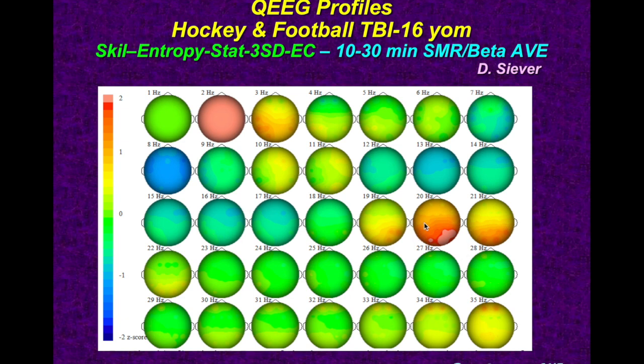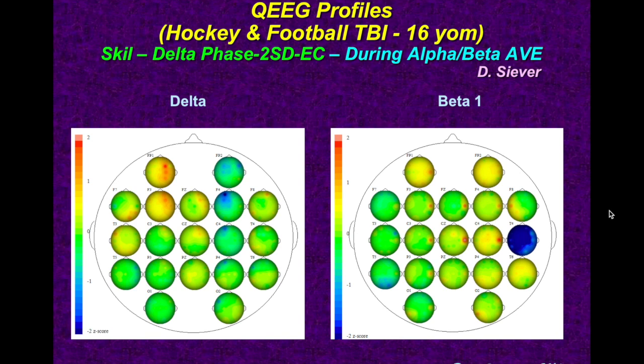We see some of the entrainment effects because we are using 20 hertz in the entrainment, and some of that has shown up at the 20 hertz level. Here's his phase. Now, all of his brain pretty much on phase was recruited back, except for the site of the injury itself. T4 is still having an issue with the rest of the brain. It's not getting on board too well. But this is only 20 minutes. Over time, this will improve.